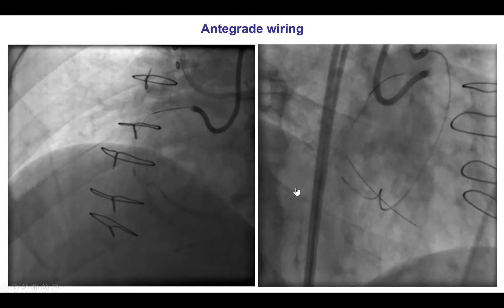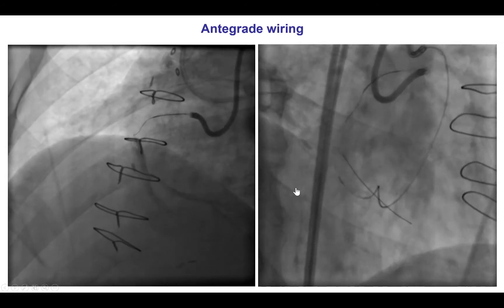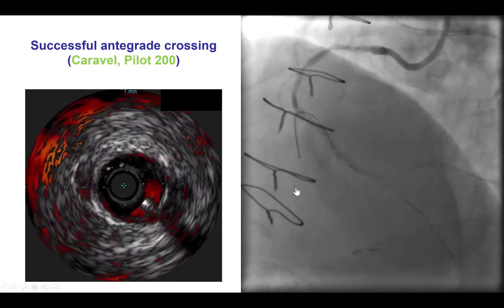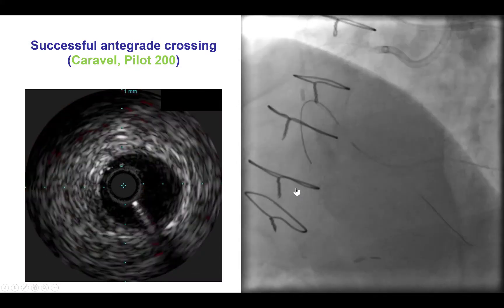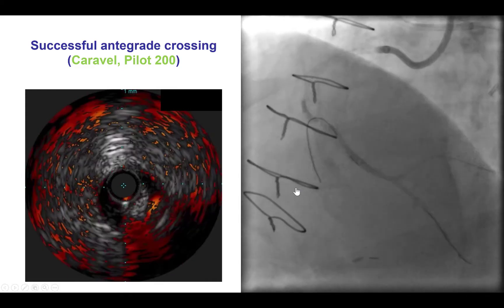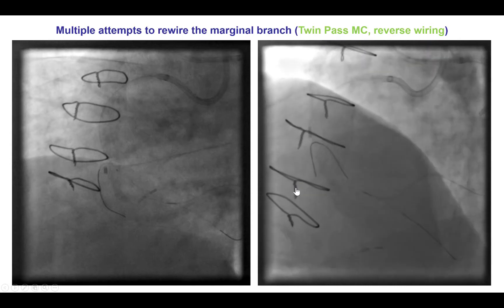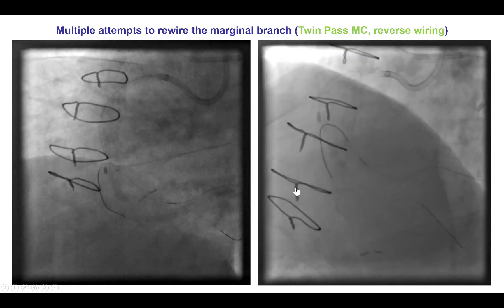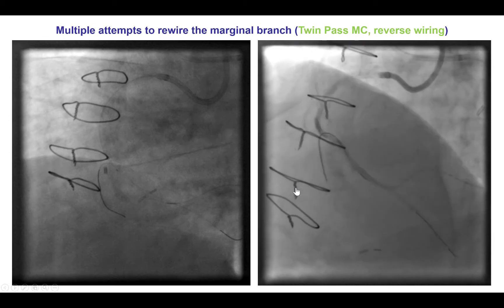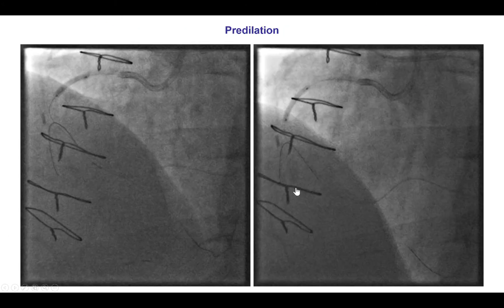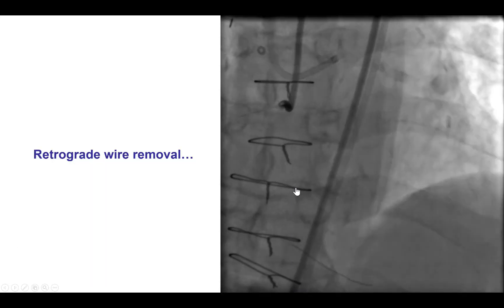We then used this as a marker to advance the antegrade guidewire, and were actually able to advance an antegrade Pilot 200 guidewire into the distal true lumen as confirmed by contralateral injection. Given the large size of the branch at the distal cap, we did multiple attempts trying to wire it — which, as I will show you, might not have been the optimal approach. We had significant difficulty, but eventually decided to leave this wire there and perform pre-dilatation.